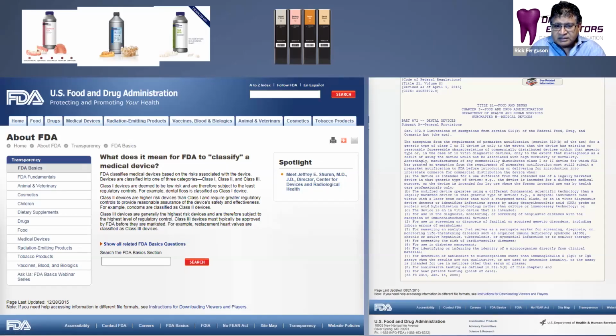It's also important to understand that not all 3D printable materials are the same. It's important that you use materials that are FDA classified or CE classified, that are safe to use in the mouth. What we're talking about here are surgical guides, which according to the FDA are classified as a class 1 material. The temporary hybrids are class 2 or class 2A, which are more for longer term use. But the surgical guides carry the least amount of restrictions as far as classification. So make sure you buy products from dental suppliers for anything that's going in the mouth.